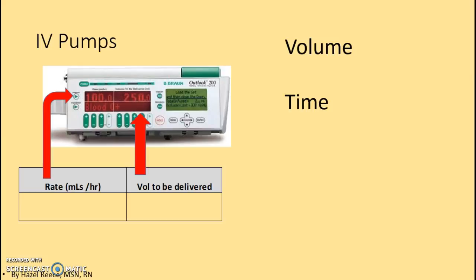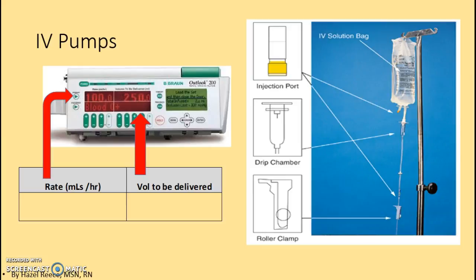So when you want to deliver medication, you need to add the medication to a volume of fluid, and then you can administer the medication to the patient. So here is a main IV. It's 1,000 milliliters. You have an IV port there. It's an injection port. You can take a needle and put medication into the main IV should you want to do that.